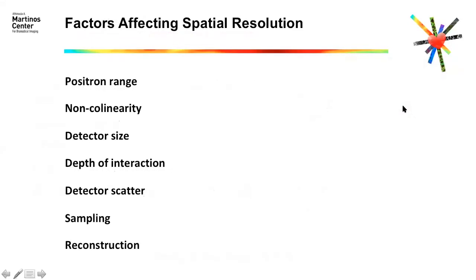So, what are all the factors that affect spatial resolution and PET, positron emission tomography, quality? There are many. There is the positron range, yes, how much that positron travels, because it's high energy, before it annihilates with an electron. That will have an impact, because we are assigning the line of response to a slightly different source from the origin of it, yes. I don't want to enter into that here, but that will affect how well we are able to detect smaller objects.